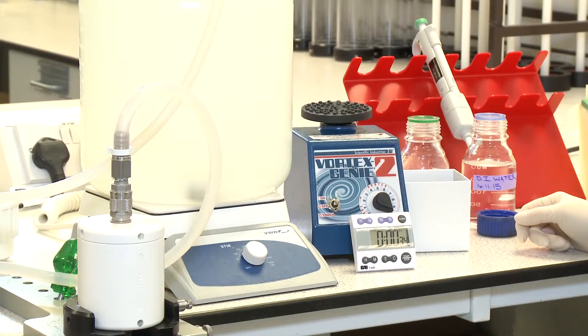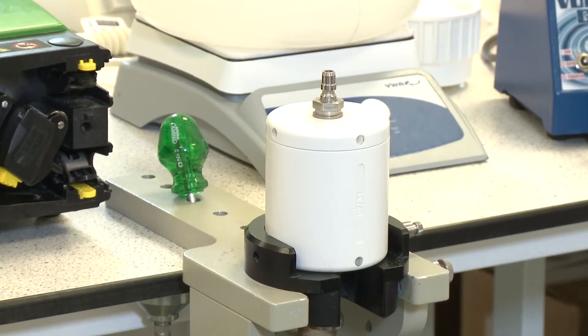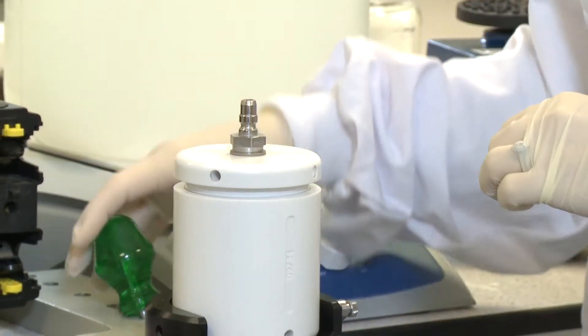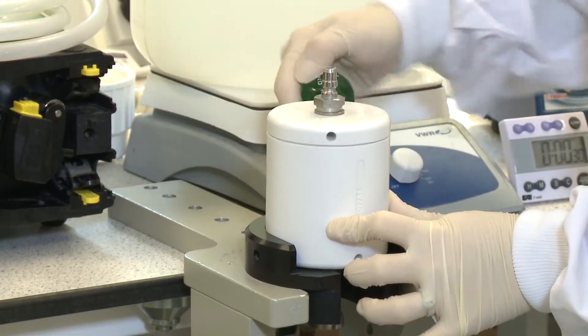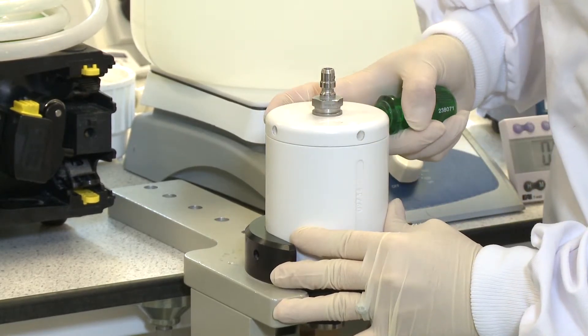First, place the carboy containing the sample onto a magnetic stirrer plate. Take an IDEX Filtamax Express filter housing and place a filter module inside the housing, ensuring that the bolt head is facing downwards. Tighten the lid using the green housing tools provided, ensuring that the lid and base tag holes align and the housing is not over tightened.